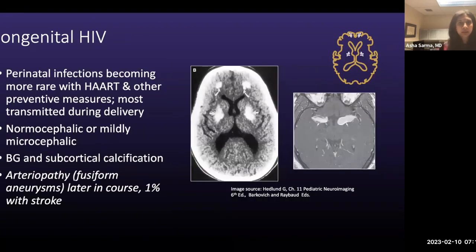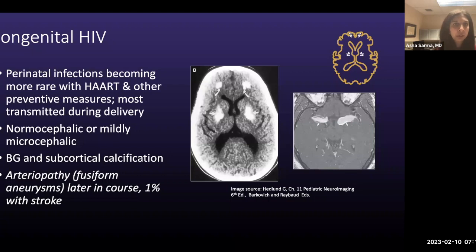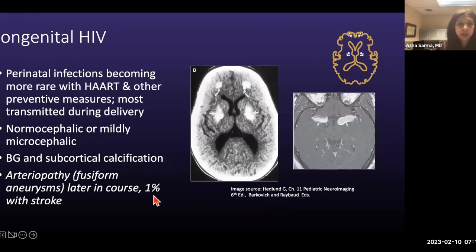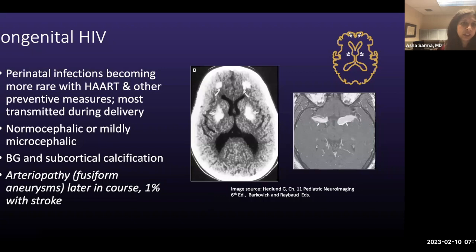Congenital HIV is something I haven't encountered much in my own practice, but important to mention. Nowadays, perinatal infections are becoming more rare with highly active antiretroviral therapy. Most cases are transmitted during delivery, though transmission can occur during breastfeeding. Patients tend to be normocephalic or mildly microcephalic. Characteristic calcifications include basal ganglia or subcortical calcifications, especially in the frontal lobes. Patients presenting later may have arteriopathy — here's a distinctive case showing fusiform aneurysms of the MCAs — and 1% may present with strokes.